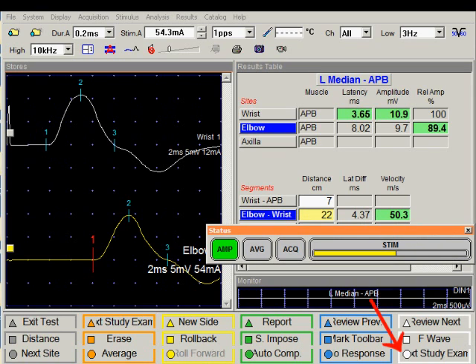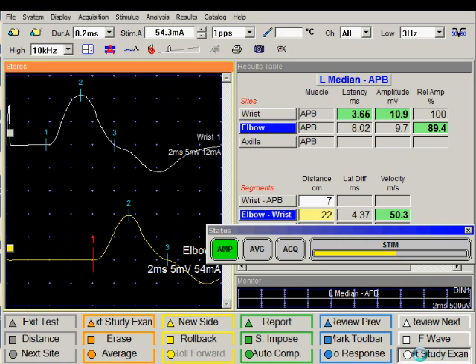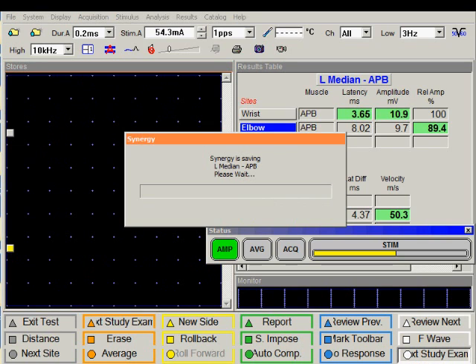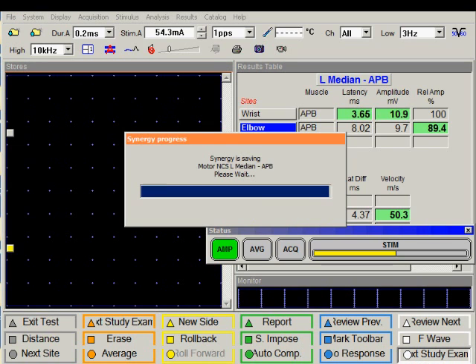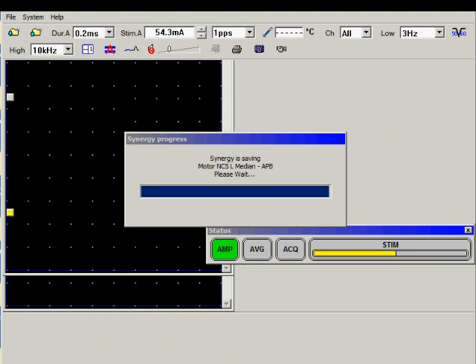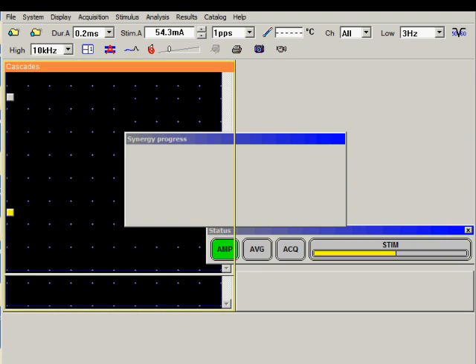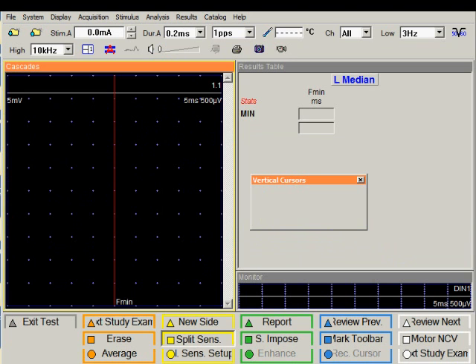I can advance to the next examination by pushing the white circle key on the console. Or I can click on the screen in the bottom right corner. The current test is saved automatically and the F wave study of the left median nerve is launched. Once again, note that the selection of the next test was very easy to make. And I did not have to click multiple times to select the nerve or the side. Again, reducing the number of errors.